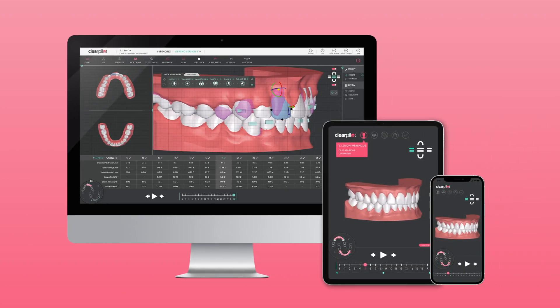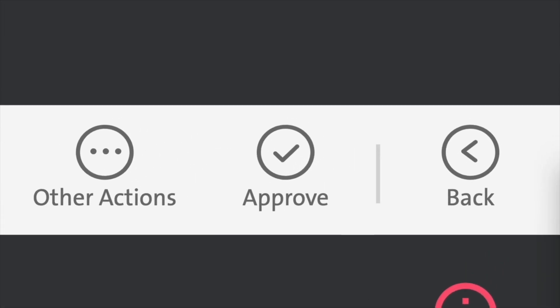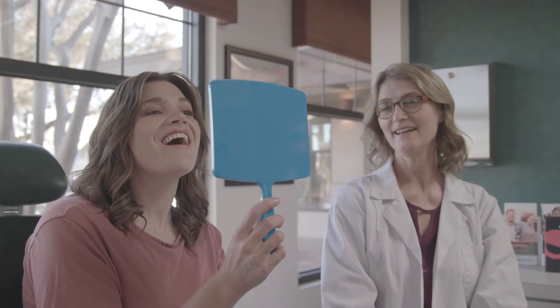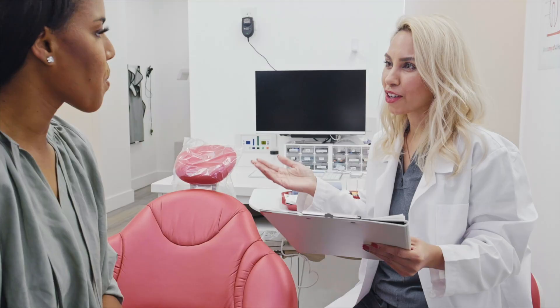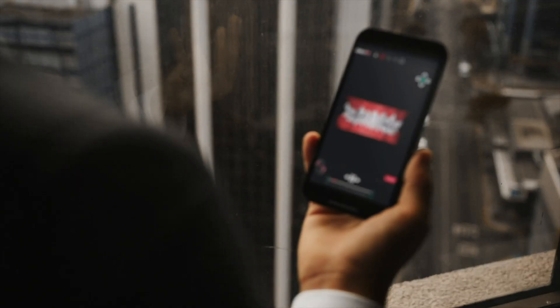We built ClearPilot with flexibility and accessibility in mind. That's why our intuitive, web-based software lets you review and approve treatment setups anywhere, anytime — whether at the office, at home, or on the go.